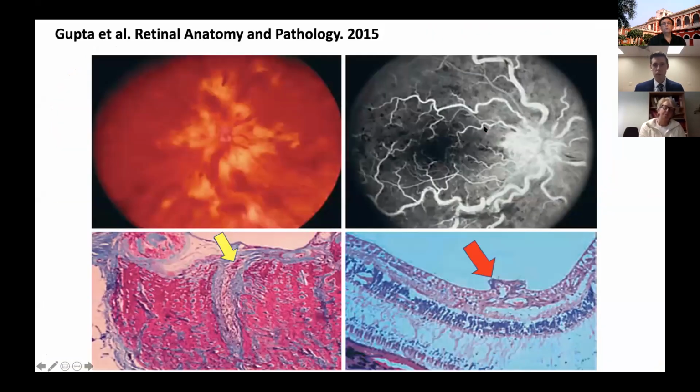And then one more time to hit that blood and thunder. This is a central retinal vein occlusion. A ton of blood just on this photo here. This is from an article by Gupta et al. They did an excellent review of retinal anatomy and pathology back in 2015, and these are shots taken from that. This is a fluorescein showing the dilated retinal vessels, extremely dilated veins blocking from the hemorrhage, and then you can see just how extensive this involvement is, and it's definitely a central process.